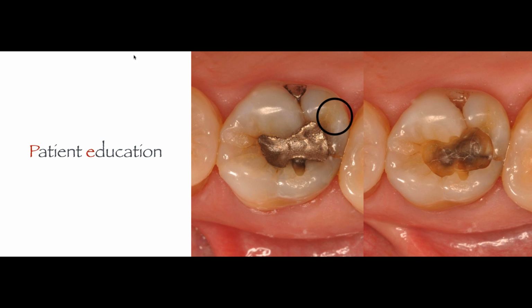Patient says, no, doctor, I'm just here for my regular checkup. I just need to get my teeth cleaned. So I do a screening exam. I'm going to do a periodontal exam. I want to make sure everything is okay. And while I'm doing that screening exam, I find this tooth.